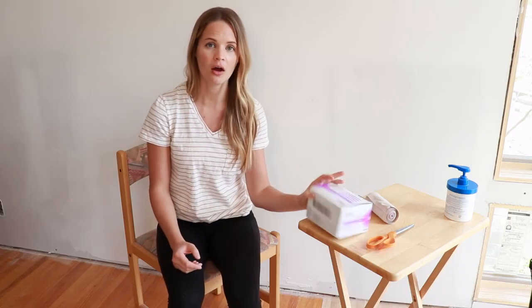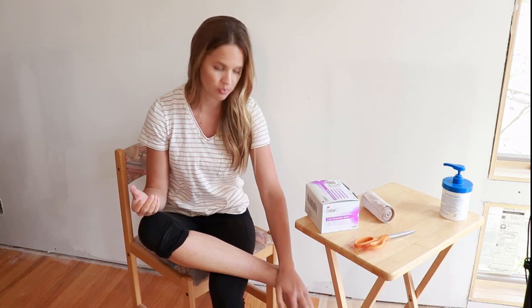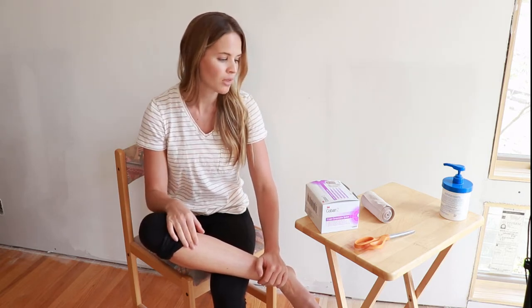The only things you need are a box of Coban and scissors. Some people may have tape ready as well. Make sure you put your lotion on first so your skin is moist, but let it dry so there's not too much moisture under the bandages. Always do your skin checks prior, making sure you don't have any cuts or openings. If you're more prone to irritation — especially at the front of your ankle, behind the knee, or inside of the elbow — you can use your Artiflex or soft foam to pad it a little so you don't get as much pressure there.